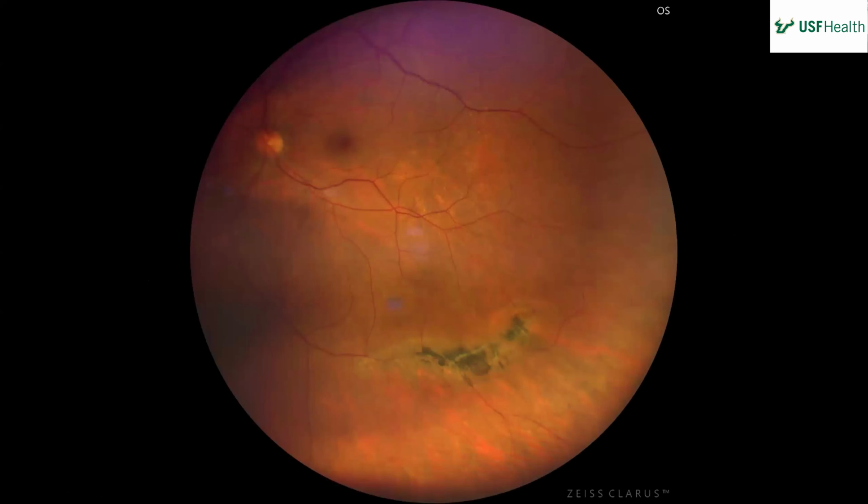Okay. So this is the colored fundus photo of the left eye. We see this patch of pigmentation inferiorly, surrounded by a more pale color as well. The vessels do look a little bit attenuated, I would say, especially inferiorly. I can't tell if there's any elevation or subretinal fluid or schisis there, but we'll keep that in the back of our head and maybe get an OCT of that area.